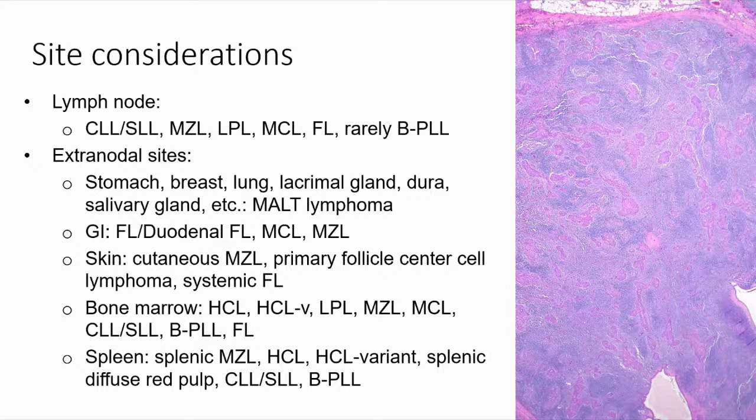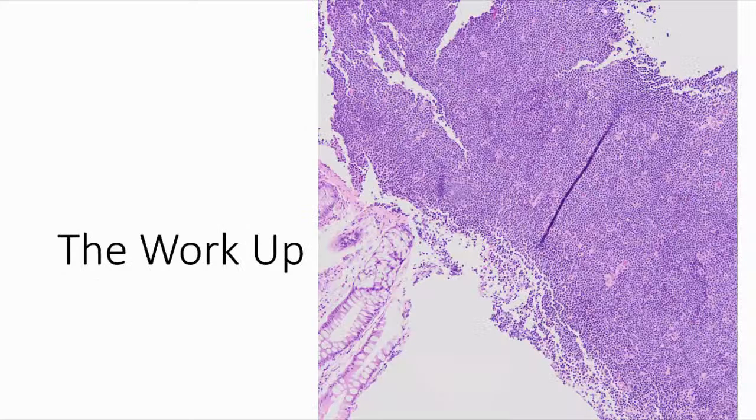All right, so the workup. What should we do? First we look morphologically. We've got a specimen with an abnormal lymphoid proliferation. This is a colon that clearly shows something that doesn't quite look reactive. It's a monotonous-looking proliferation of small lymphoid cells here. And because it was a colon polyp, it wasn't sent for flow cytometry.